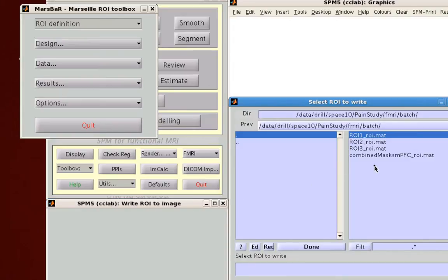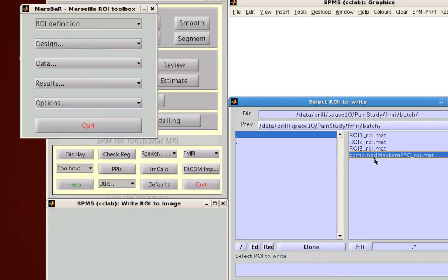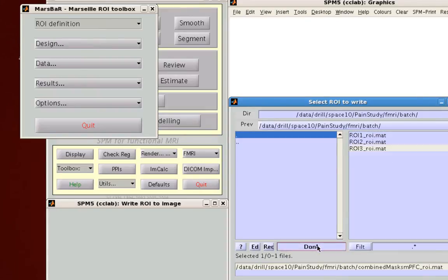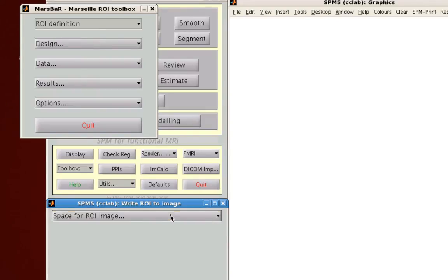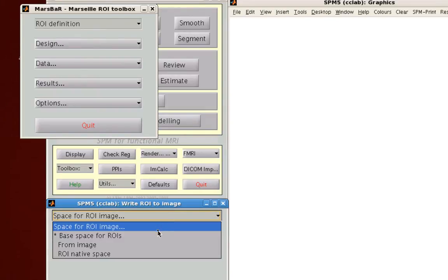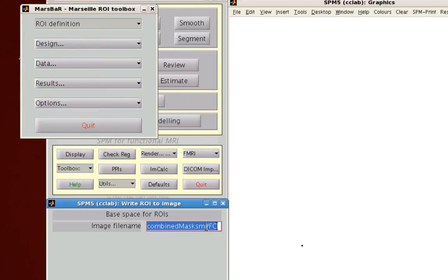It'll change slightly how you actually extract parameter values with MarsBar. Just select your mat file and then base space for ROIs, and select the directory where you want to write out this file and what the file name should be. And then you're done.